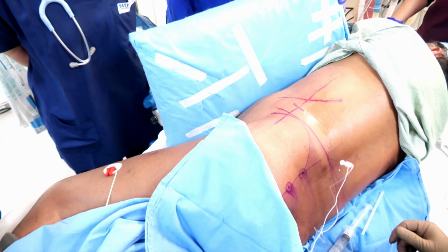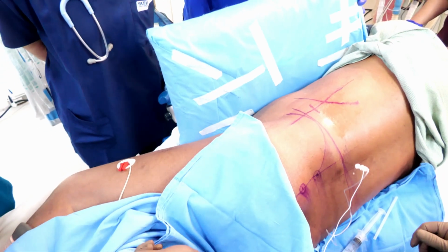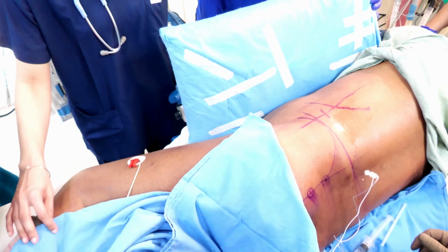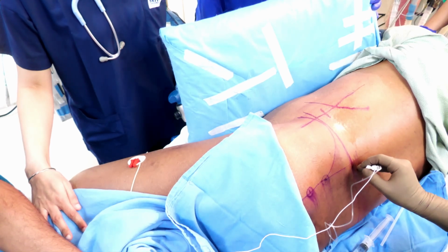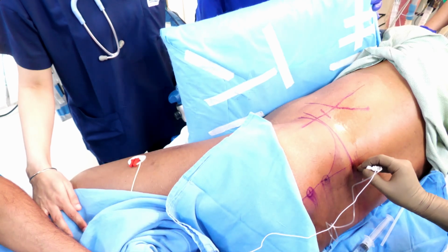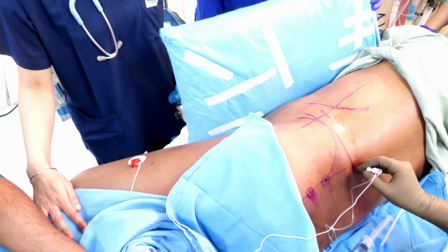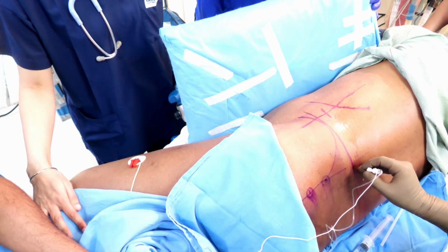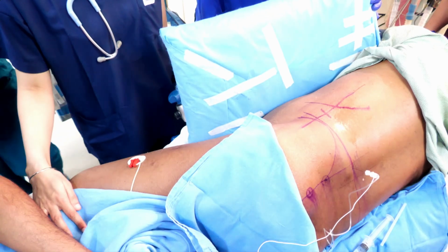So I will ask him to reduce the current to 0.87. Still more. Don't pull out the needle. Still more, lower down. Still more. It is probably intraneural, because I can see the type of contractions. You can still go further down. Can you see that it's 0.2, and you can still get the contractions.